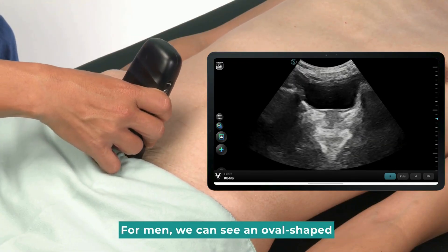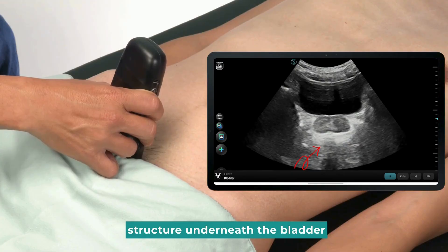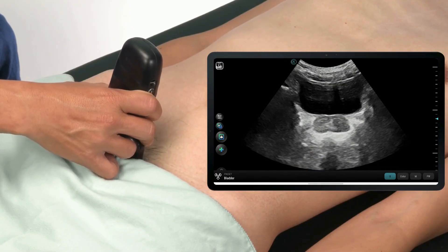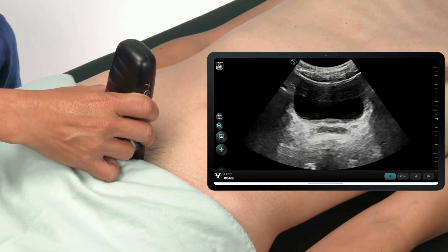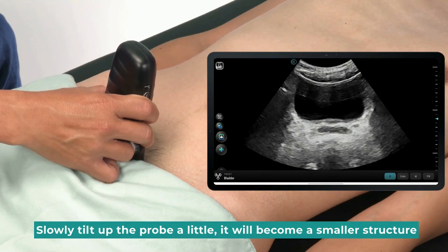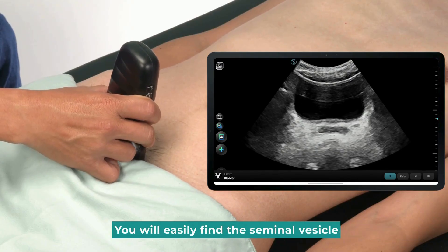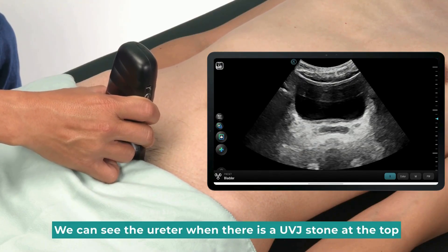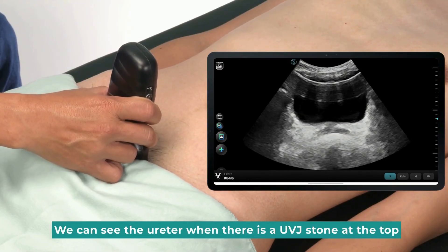For men, we can see a more oval-shaped structure at the bottom of the bladder. This is the prostate. Slowly tilt up the probe a little and it will become a smaller structure. You will easily find the seminal vesicle. We can also see the ureter when there is a UVJ stone at the top.